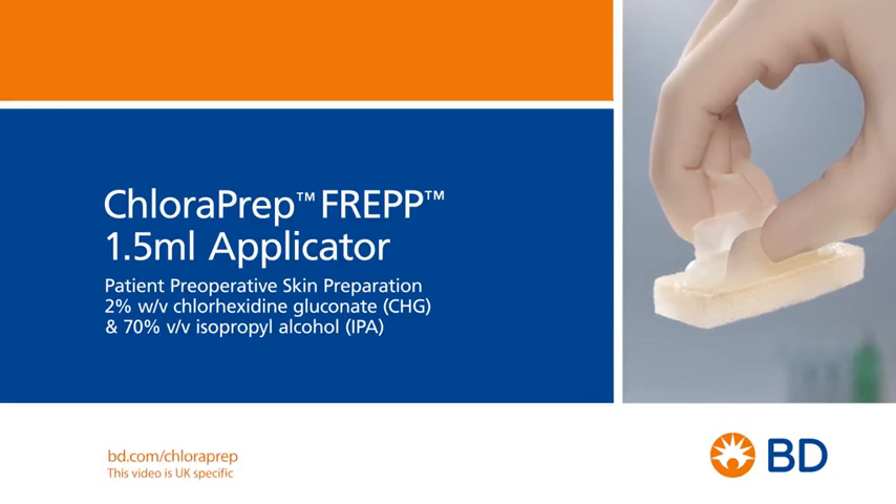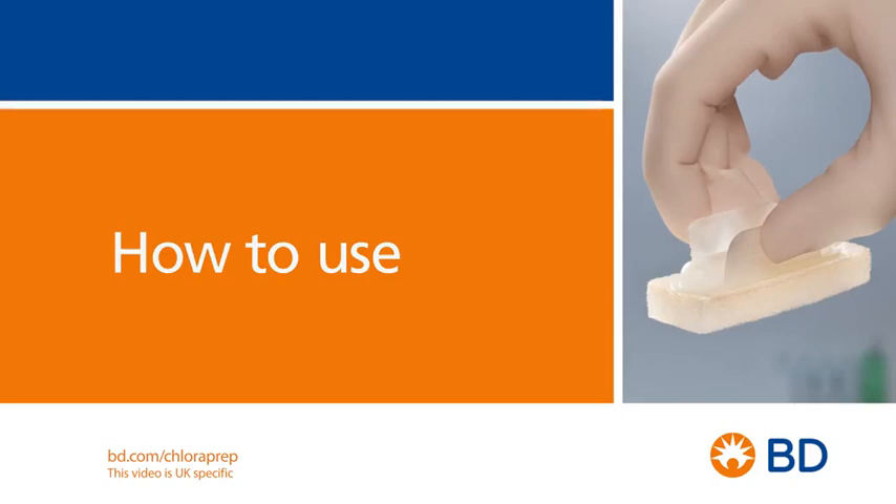Check for chlorhexidine gluconate allergy, batch number and expiration date. The Chloroprep FREP applicator is easy to use.